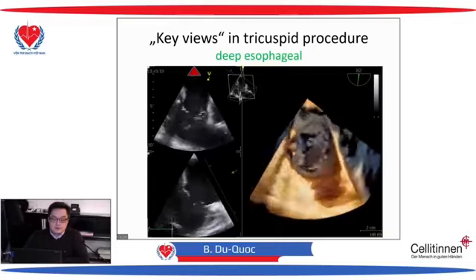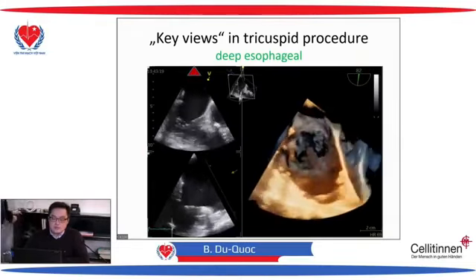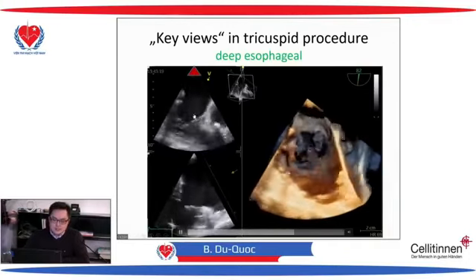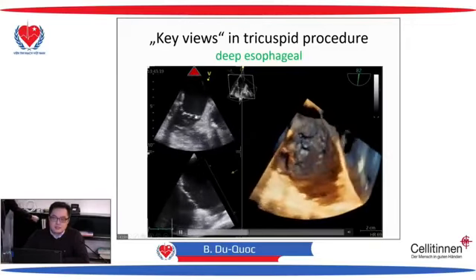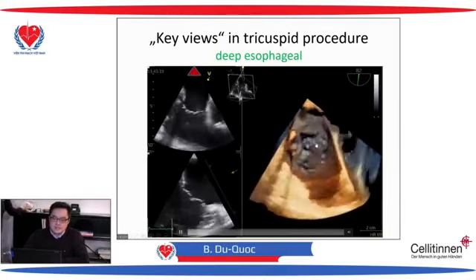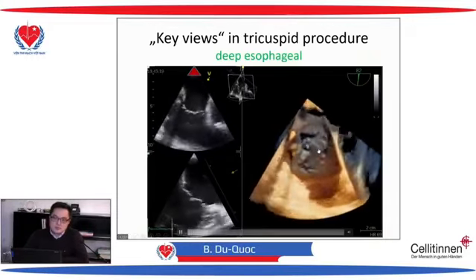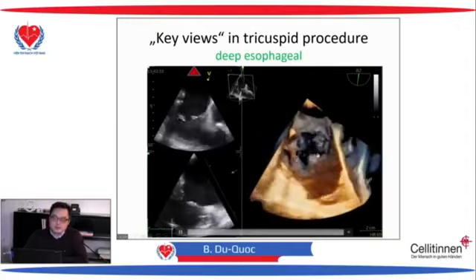In this view is very beautiful because you can do 3D or 4D real-time imaging like this view. And as you notice, the gain is very high here in this 2D picture. Why? Because we want to see the cusp, and if I turn down my gain level, then the leaflets will maybe disappear, or you have a lot of dropout effects.